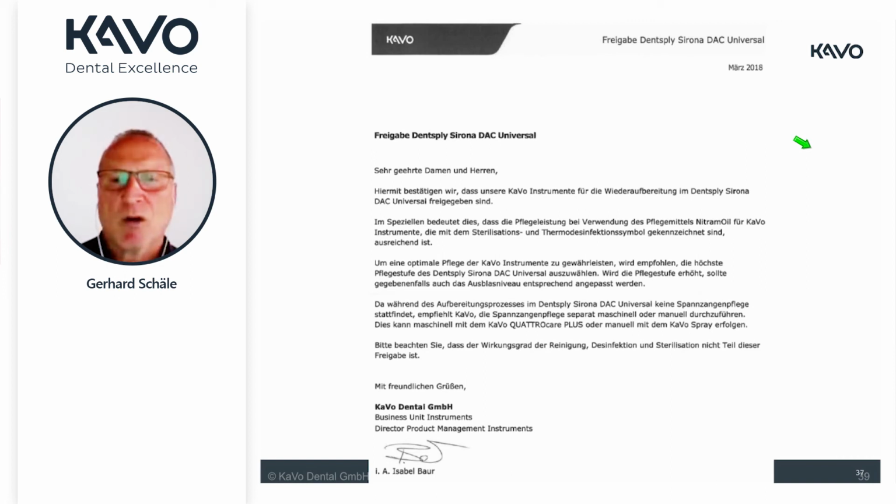But we always say that you should always bring, and this is also written down in the Sirona manual, that you always have to increase the oil quantity to the maximum. That's the important point. Here it's written down to have an optimum of cleaning, just only in German, but I just translate it. We recommend always to use the highest step of the oil.